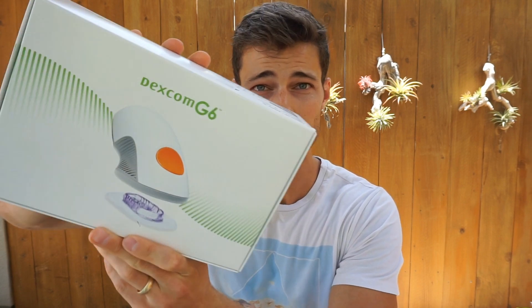Finally got the sensors in the mail. So I'm going to show you guys what is inside, what it looks like, what to expect, and what's different.